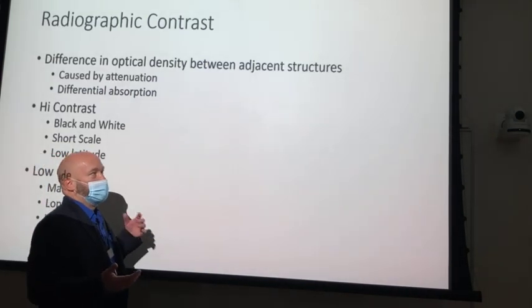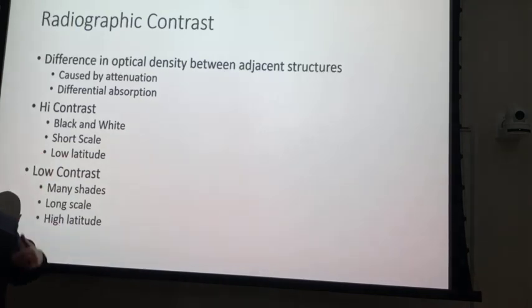If we're talking about contrast and visibility of recorded detail, we'll say visibility of recorded detail or contrast resolution, okay? So resolution, just resolution itself, is detail. Contrast resolution is just contrast, okay?